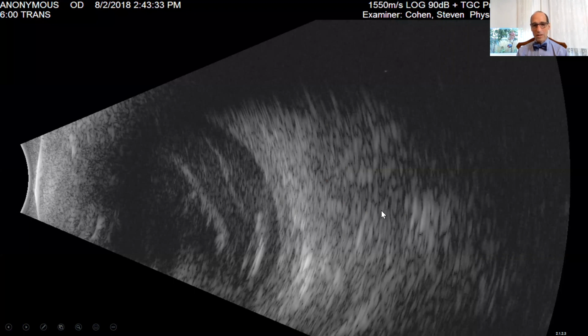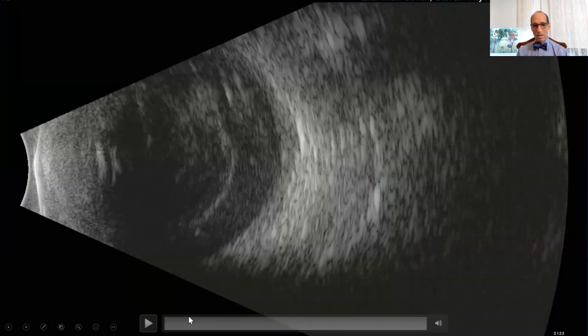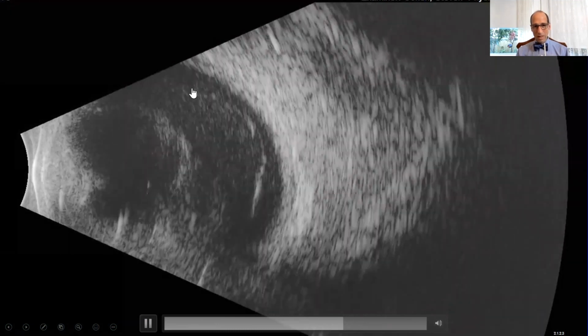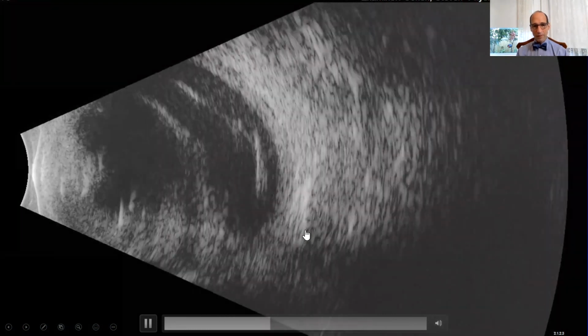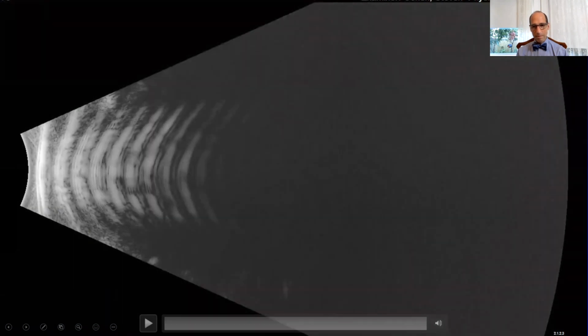This is a patient with a vitreous hemorrhage and these hyperreflective things. And that's the same patient. And then here's a movie, and you have to decide, is that a retinal detachment? So you see this, here's something that looks like maybe blood, and then here's this other thing back there that looks a lot like a retinal detachment. I'm not looking at your images, so you can raise your hand to yourself if you think that's a retinal detachment. Okay, and then I'll show you another image, because it's a big deal.